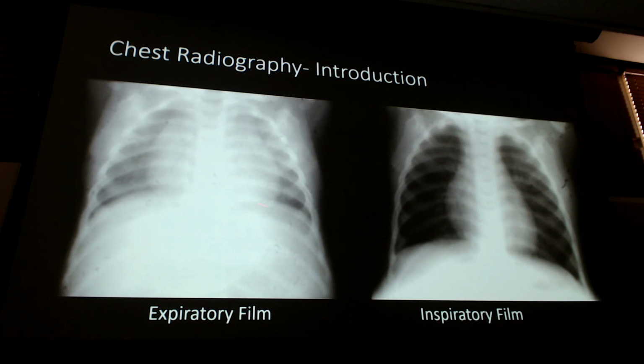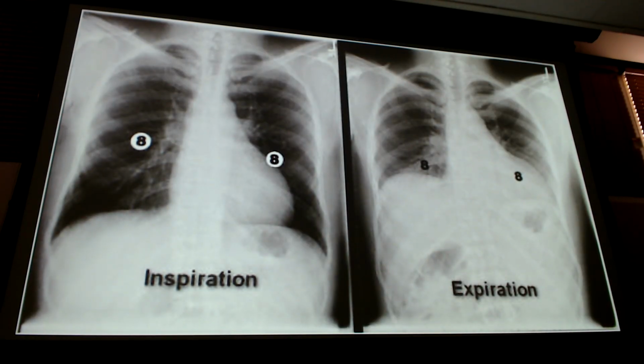We don't get hung up on cardiomegaly for the kids because look at how much different the heart looks. But what I use this slide for in particular, and you can do it with the adult too, look at my heart on my inspiratory. Look at how it looks in the same patient with my expiratory film. See how the heart shoots almost all the way out to the wall of the thorax?